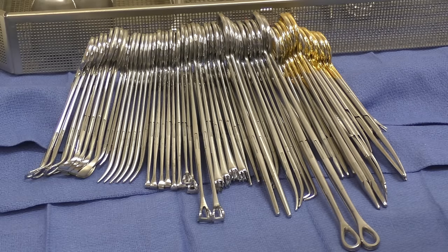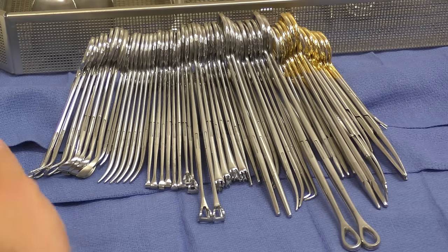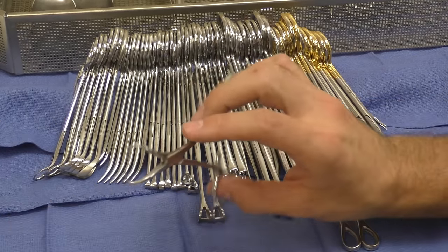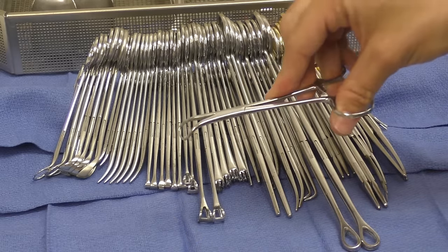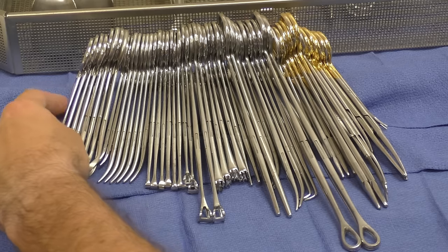All right, now we're going to start this tray off by just going through the general instrument stringer that we have here on the roll towel. So starting it off, we've got four sharp towel clips, also known as the Backhaus towel clips. As you can see, very sharp. These can pierce the patient's skin, and a lot of the time surgeons do use it for that application.